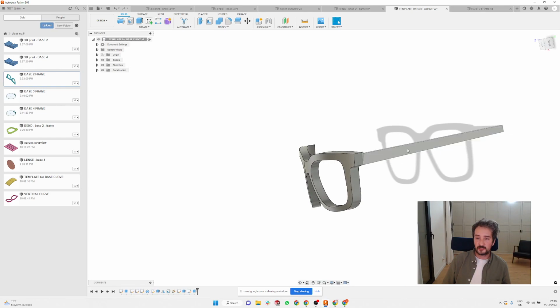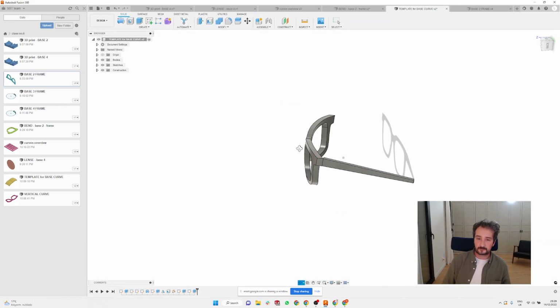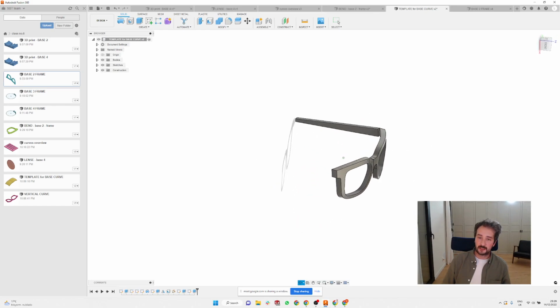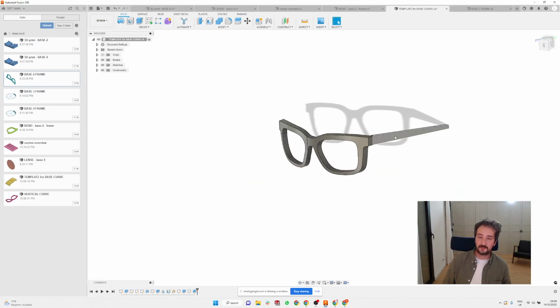And also, if you don't know which kind of pantoscopic tilt you want, you can always see here, you can try different angles and see how it fits with the frame. Yeah, so something like this, and you can just mirror it on the other side. You can add little hinges. If you already have some 3D model of hinges, you can just add them here and make something much closer to a real frame.